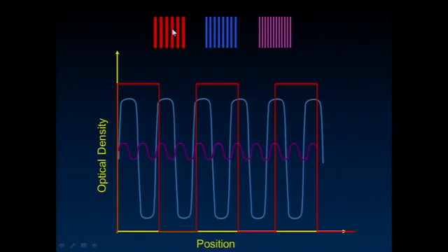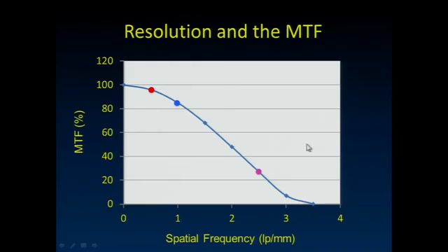And it turns out that most systems, as you try to drive to higher and higher resolution, in other words, if you take a look at more line pairs per millimeter, you go from a very good fidelity, resolution properties, to much poorer properties. And every system has some limiting resolution where basically this looks like a flat line. When you take an image of that phantom with very high number of line pairs per millimeter, it just looks like it's uniformly gray, if you will.